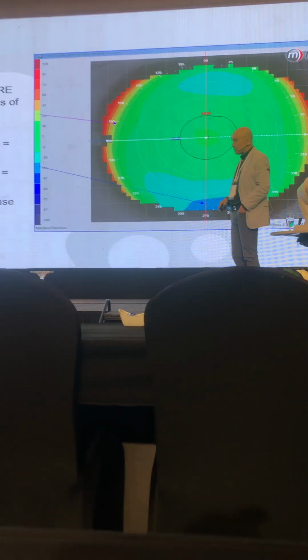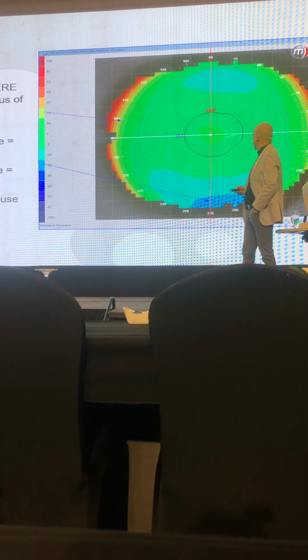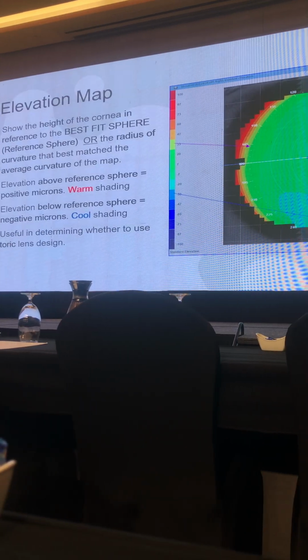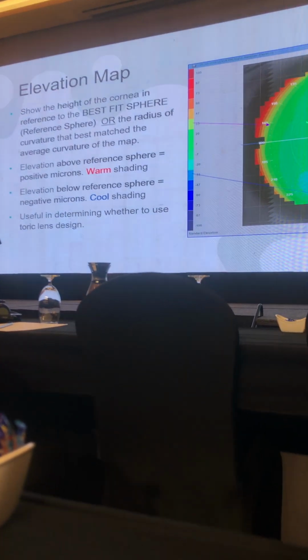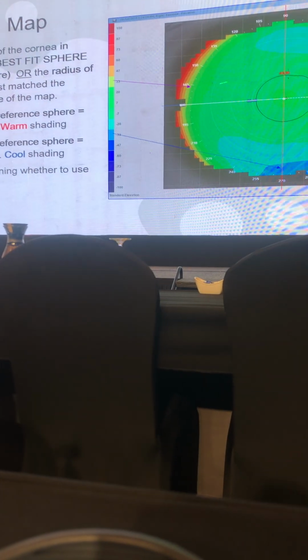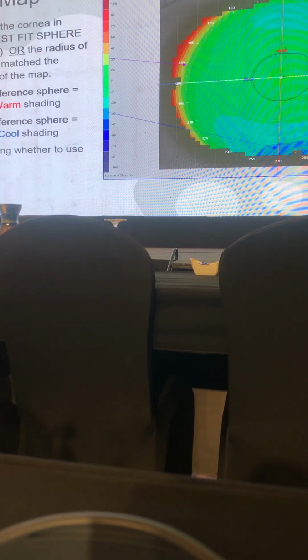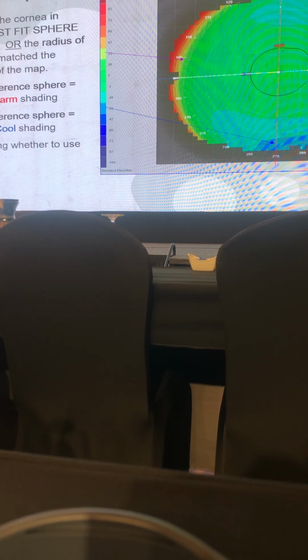Especially when you look at small toric design lenses, in the more advanced toric design lenses like four zone, quad zone, we might encounter some corners that are really flat and steep here. I would say more flat here, more steep than underneath. So this area, the blue zone here, is different from the blue zone at the top of the cornea.